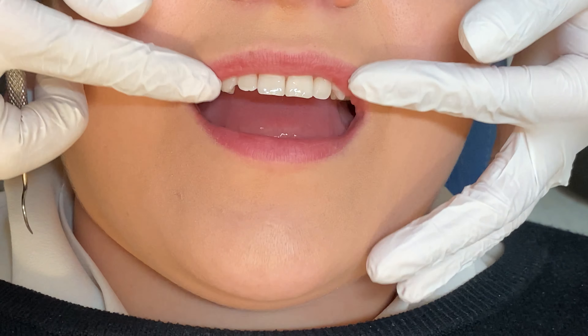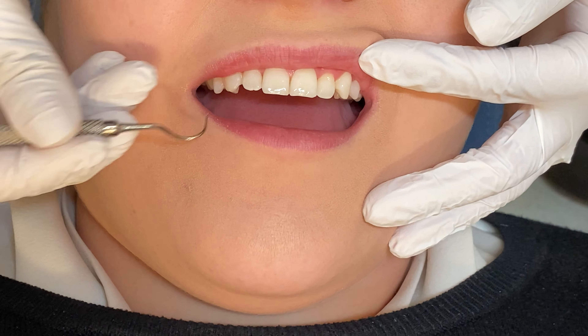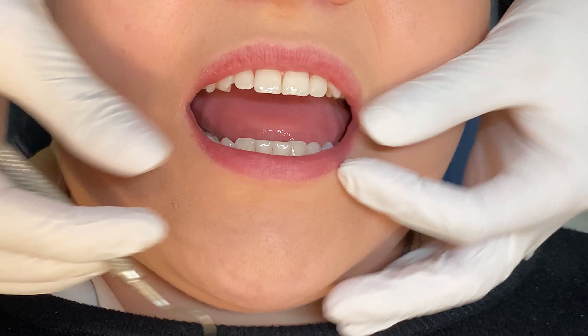For an ideal Invisalign result, your orthodontist may prescribe the need for interproximal reduction using a fine diamond coated strip. A binding contact means there is a tight contact preventing your teeth from moving freely. Therefore, we're asking you to check the upper and lower front six teeth for binding contacts.